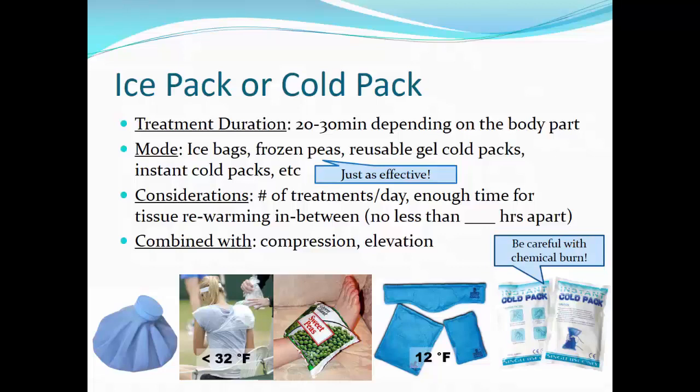There are several considerations for the use of ice packs and cold packs, including the number of treatments per day, will there be enough time for tissue rewarming in between treatments, and patients can have treatments no less than 2 hours apart. Oftentimes, ice packs or cold packs are combined with compression and elevation to enhance the treatment.